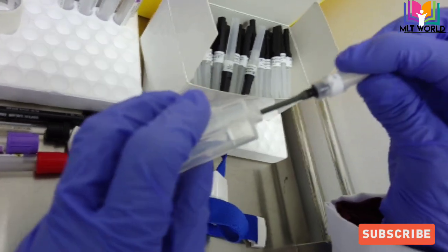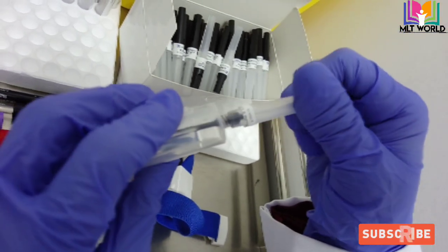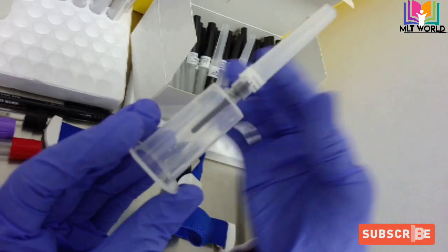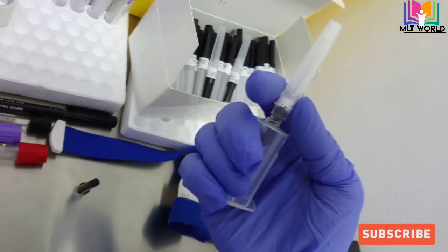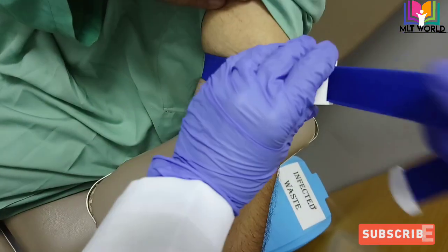Now just pull this and it will open. This black rubber point you will insert inside carefully, because inside that rubber there is the needle. Insert it like that, then close and tighten it.